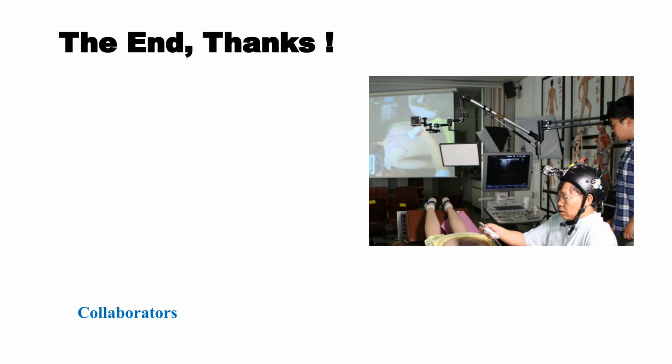In my teaching, I am prioritizing the use of ultrasound imaging when we cover meridian and acupoint theory and needling techniques. I believe we must combine anatomy and acupuncture, emphasizing that treating various conditions is an intervention with a crucial physical component. In conclusion, acupuncture is a therapeutic technique that involves the patient's response to the practitioner's stimulation. Ultrasound helps us safely and effectively bridge traditional practice with modern evidence-based anatomy, ensuring we hit the right target every single time.